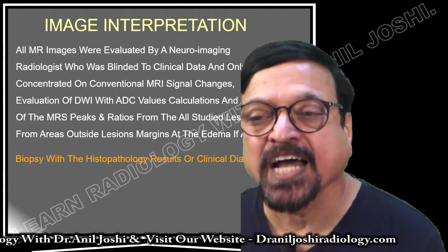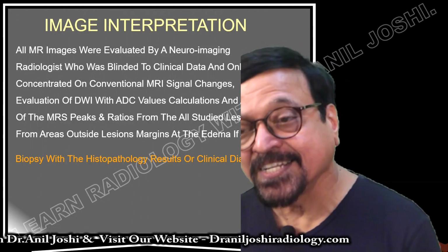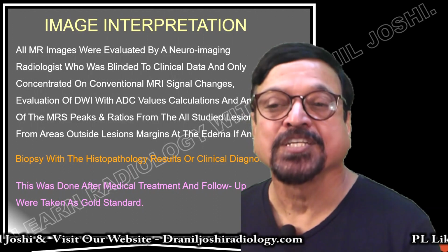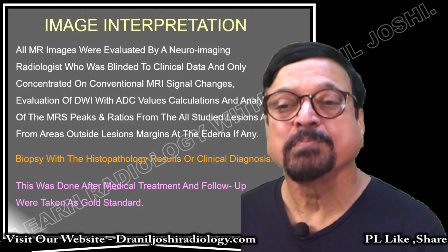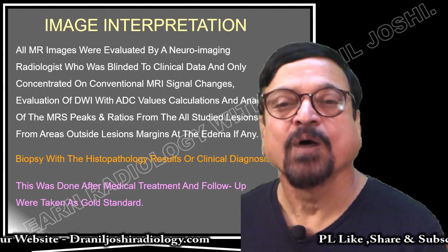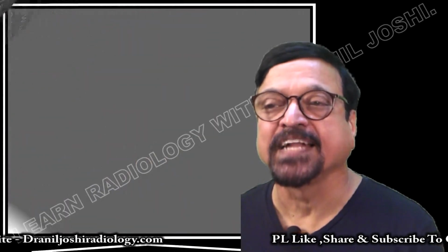So histopathologies are important. Clinical details are important, but what MRS does is it reduces the biopsies, number one, and second thing, it helps the clinician to know preoperatively if it is a glioma, how he has to be prepared and what the subcategories of that are.